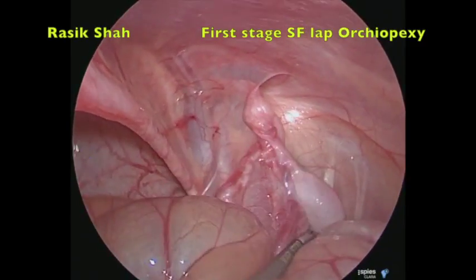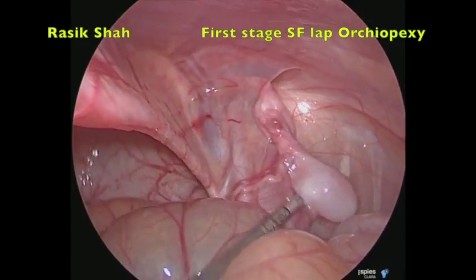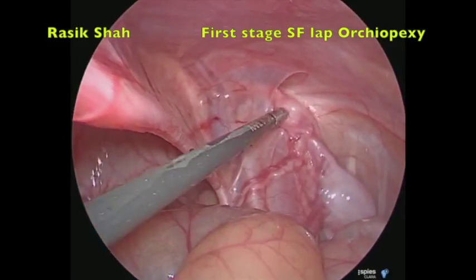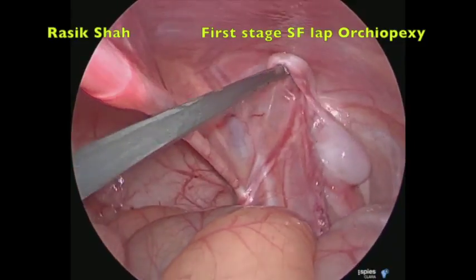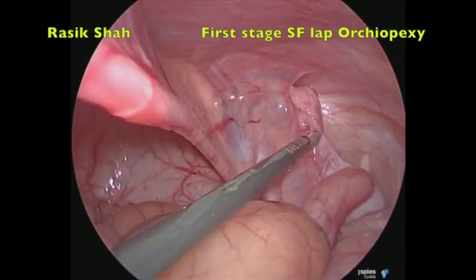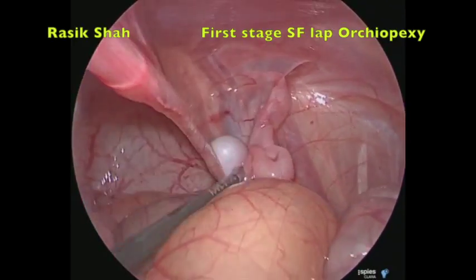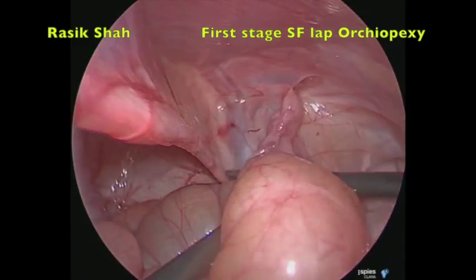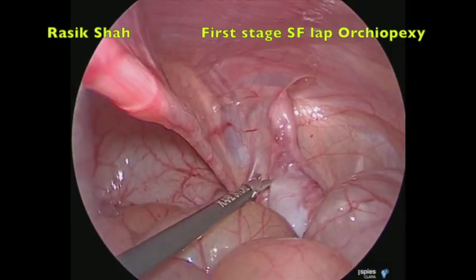We assess whether the testes can be brought down in a single stage or two stages. We have three points which will help us in deciding whether it can come down in one operation easily or not. The first thing is we measure the distance of the testes from the internal ring. If it is more than 2 to 2.5 cm, it is difficult for the testes to come down.